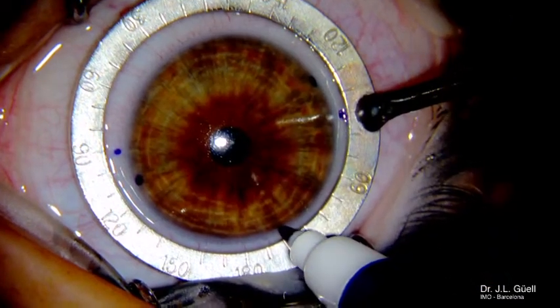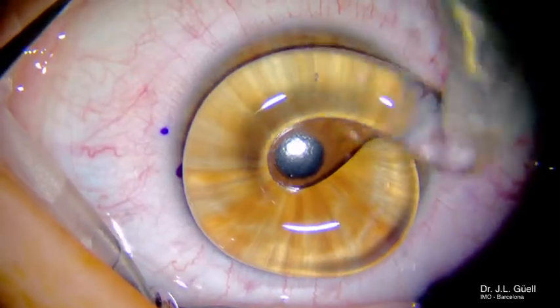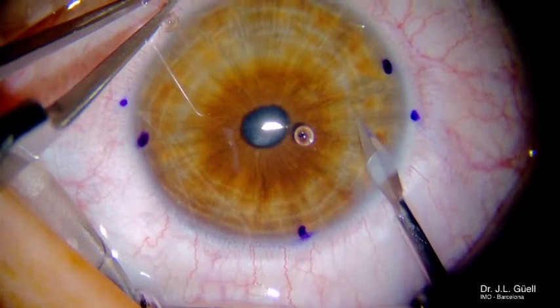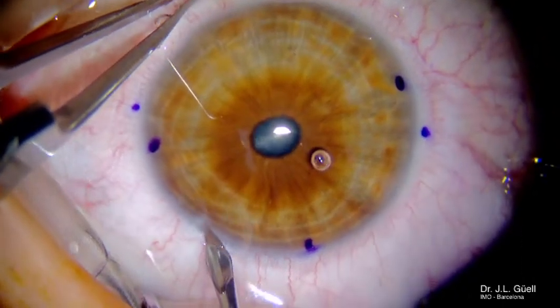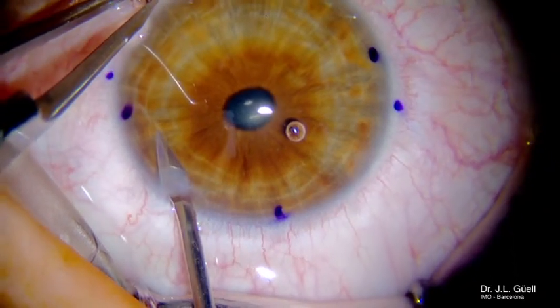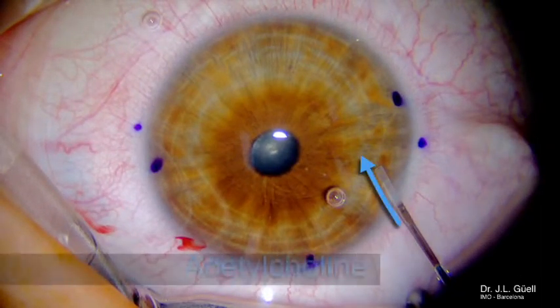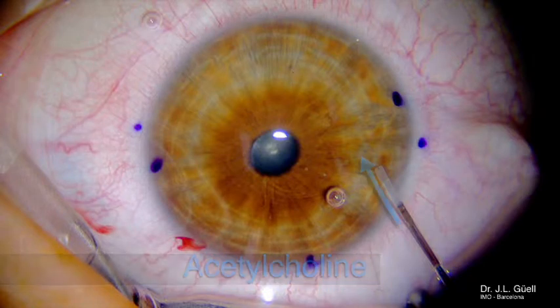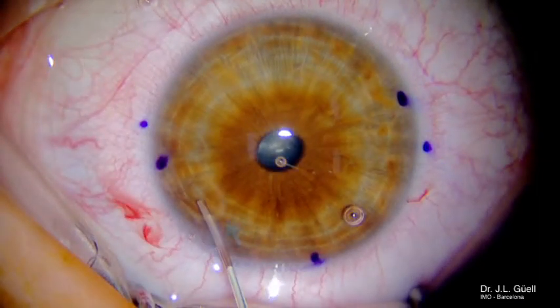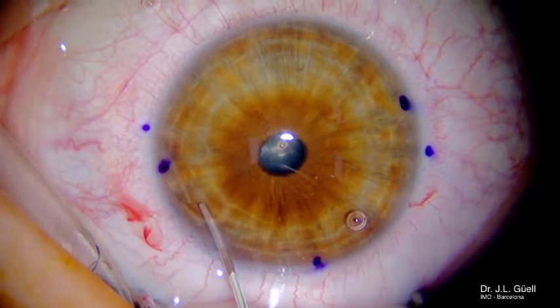Once we have it orientated, I change my position on the microscope accordingly in order to always work from the same position. First of all, we create two lateral paracenteses. Through one of them, we introduce either miochol or acetylcholine to diminish the pupil size. Through the other one, we inject a little bit of our standard viscoelastic.